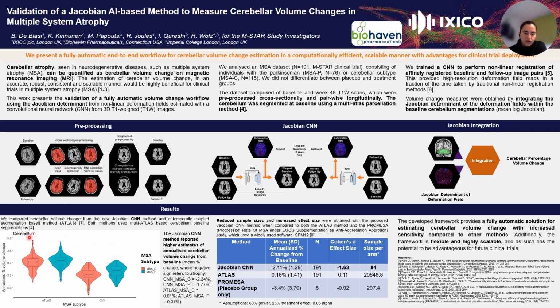At the bottom, the last row of the poster shows the results of the validation. In the figure at the bottom left, we compared the CNN method against another alternative method for longitudinal volume change, which uses temporally coupled segmentation, and we refer to this as an atlas method.